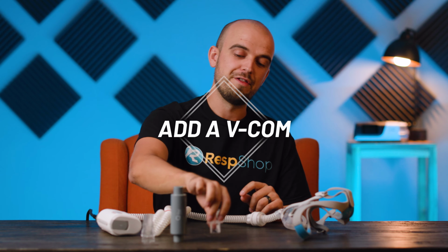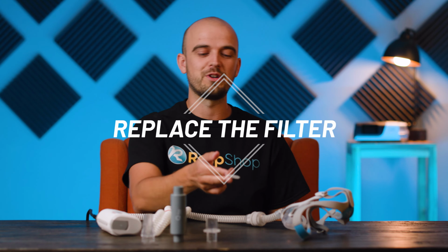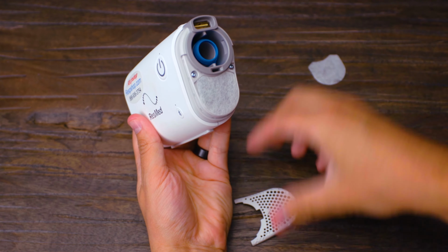And if that's not enough, we now have a VCOM. This will just make the sound more consistent, reducing the extremities of the noise. A more consistent sound while you sleep helps it to feel less disruptive. And last but not least, this last tip is pretty dirty. And no, don't get excited, we're talking filters. If you have a dirty filter in your AirMini, it can make a whistling sound, so just making sure you have a clean filter when you use it also will help your overall level of noise.